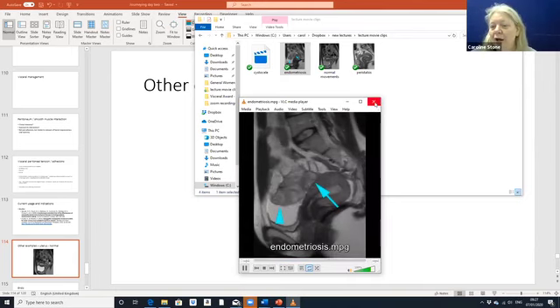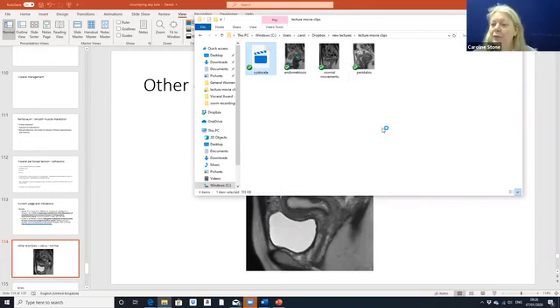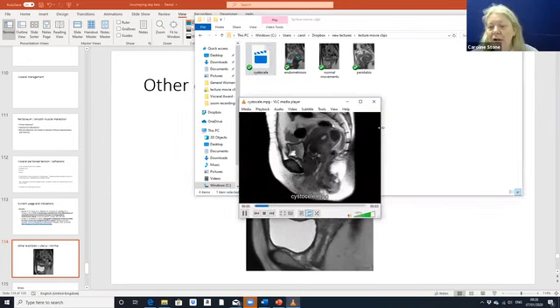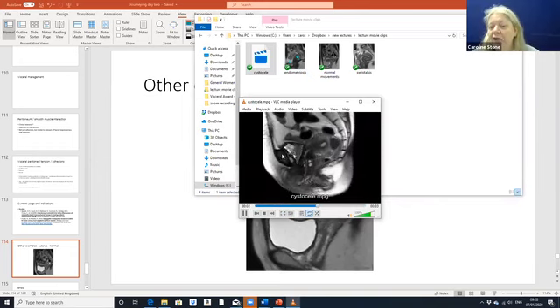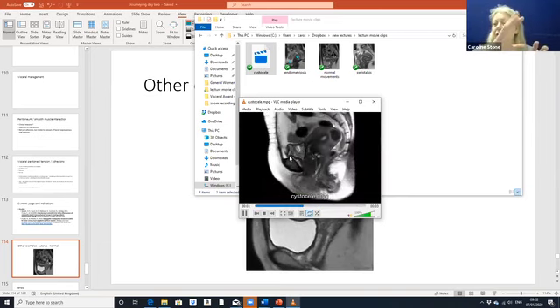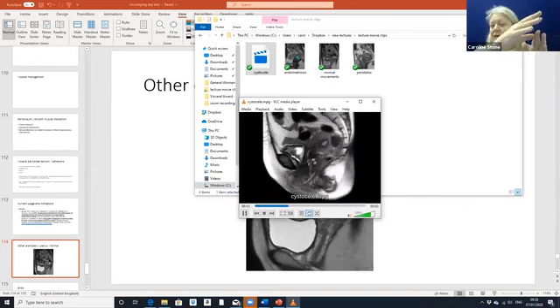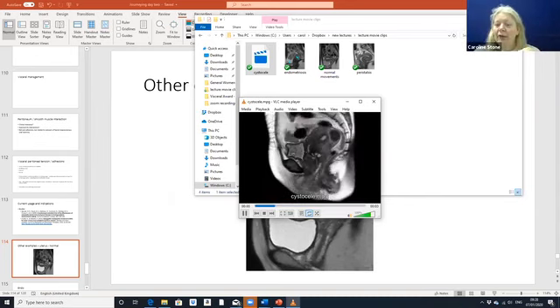Although we're not talking about prolapse at the moment, I will just play the cystocele one. So this is a bladder prolapse. I'll explain all of that separately. Now, an older woman, I think she's in her 70s. She has a peak-shaped bladder. She's doing a Valsalva maneuver. I'll come back to that. But this peak-shaped bladder is because in part the bladder is dropped. So it is a cystocele, and she also has a uterine displacement.